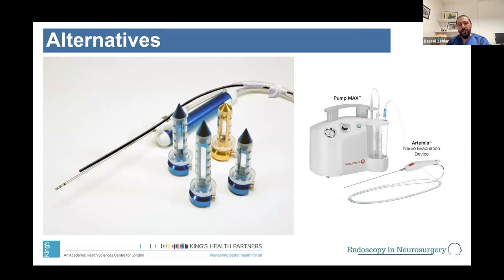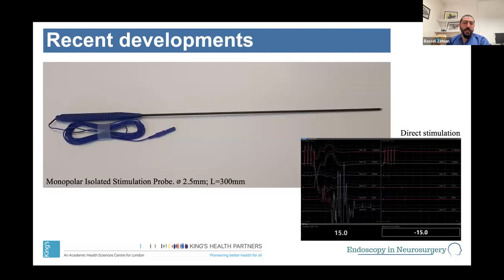These are some of the alternatives. So the brain path and using a Nicomyriad. I personally would rather not use it, although we are going to try it once more, because it's a debrider and it can be quite aggressive.